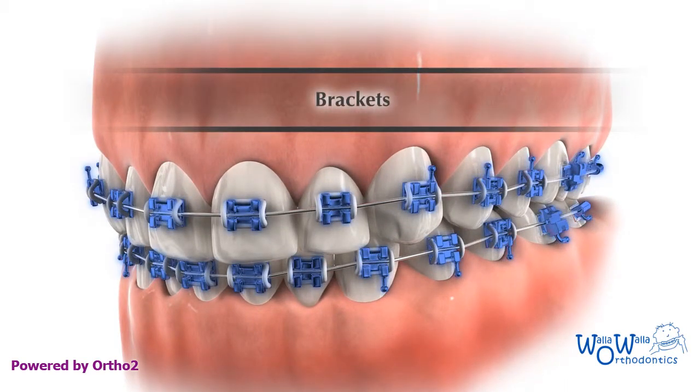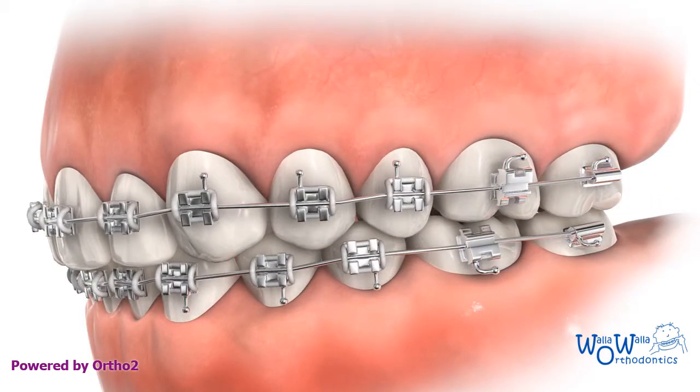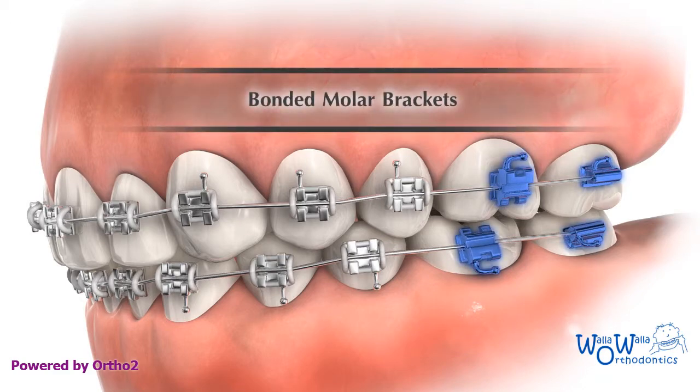The bracket is a metal device which is bonded to the teeth and acts as a handle so we can move them. Brackets are affixed to the molars instead of the traditional molar bands.